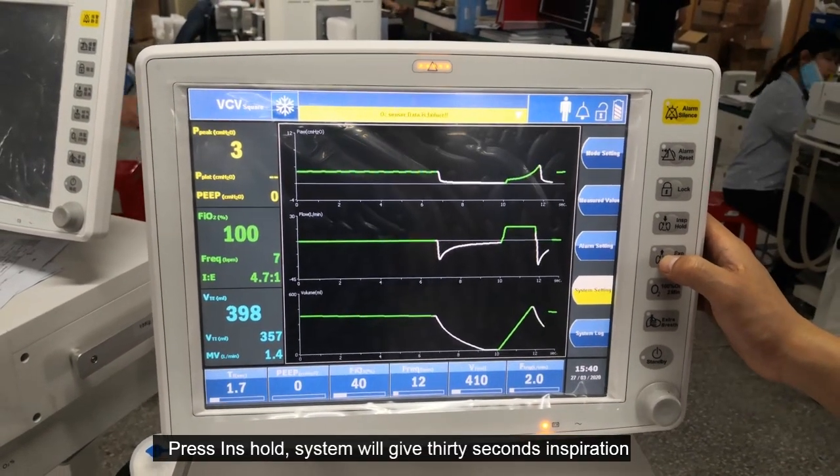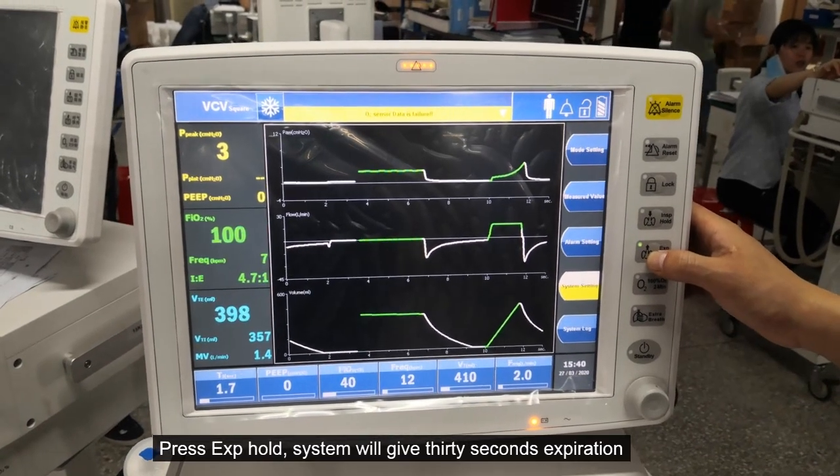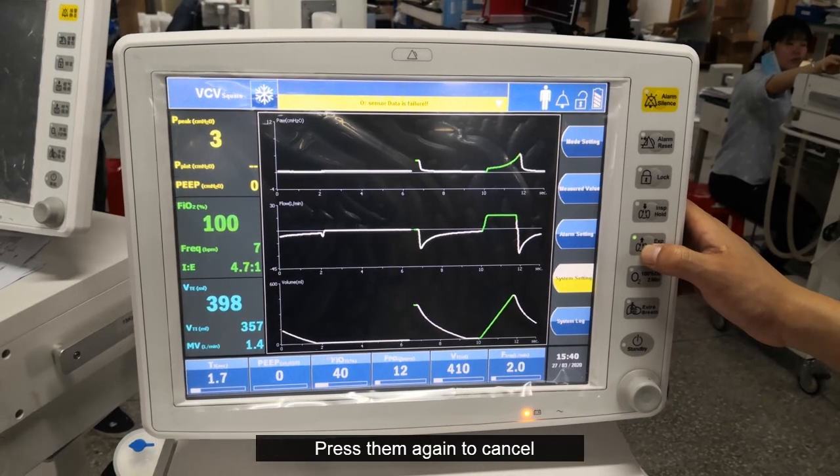Press INS hold and the system will give 30 seconds of inspiration. Press EXP hold and the system will give 30 seconds of expiration.